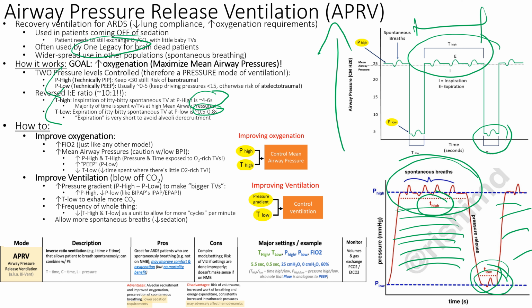Do you want to go to 10, 15? You want to go all the way down to 5? Well, this difference should not be that much. It's like the corridor example. You don't want to be opening and closing your alveoli and causing atelectic trauma. Those are called your driving pressures, so you want to keep that usually less than 15.